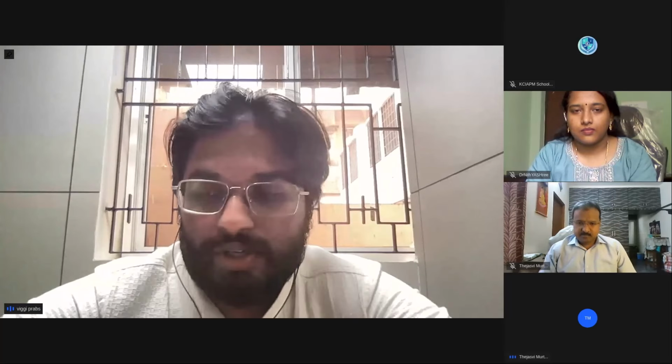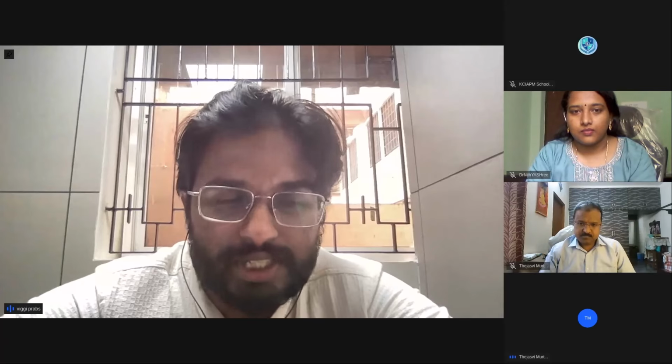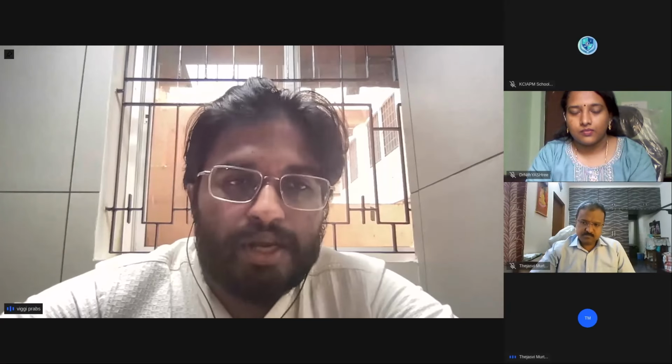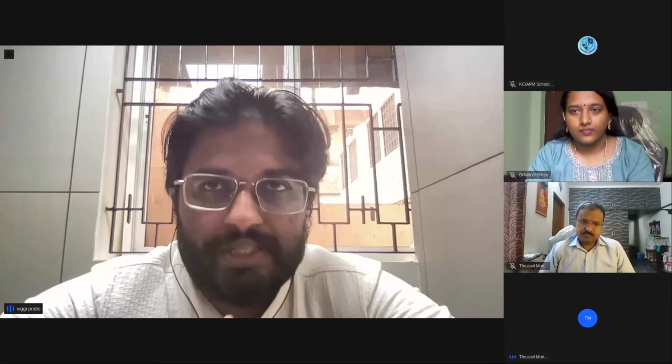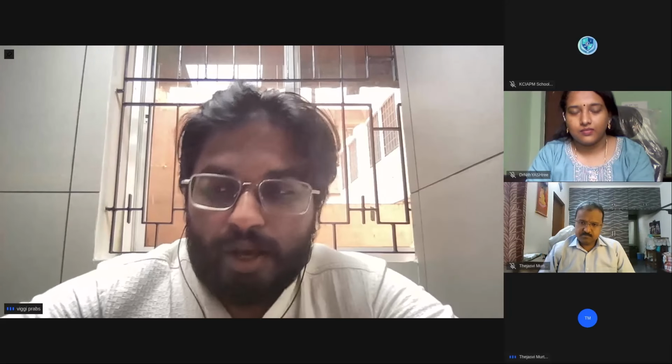In today's talk, Dr. Tejasvi will take us through the art and science of identifying these histopathological patterns and taking a step-by-step approach to diagnosing disease. And over to you, sir.